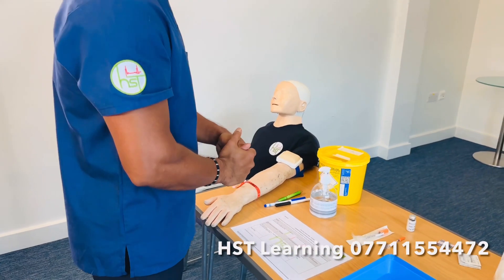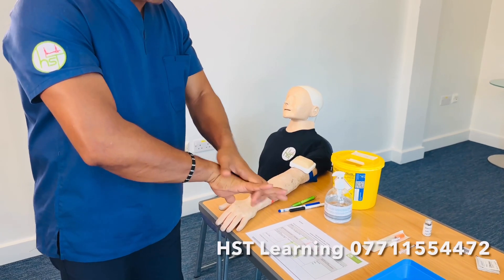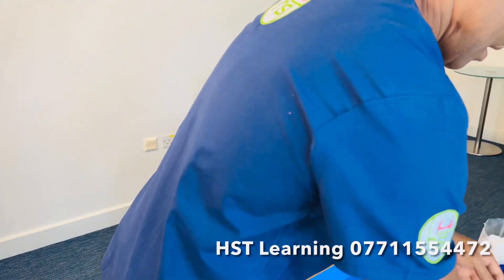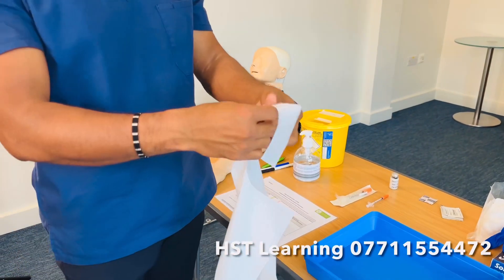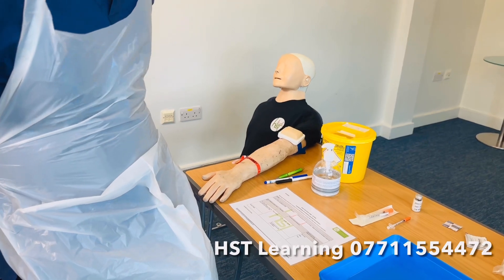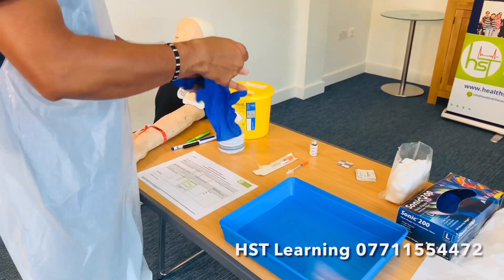Let me show you how to prepare and administer the medication without resheathing or recapping the needle. I'm going to first perform my hand hygiene — I'll only show preparation and administration here, as other steps like the ID check should be done at the beginning. Now I've done hand hygiene, I'm going to wear the apron. I need one pair of gloves — check the integrity of the glove including the expiry date.